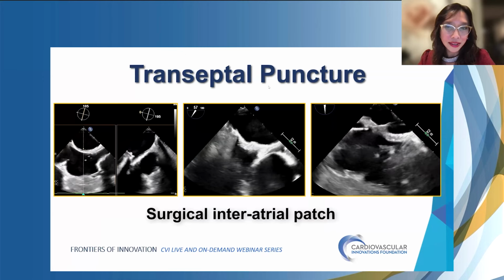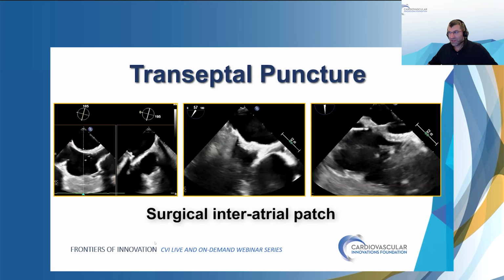And the next slide. So Nadira, just a quick comment here, and I would like to hear what Paul has to say. On the transeptal puncture, after multiple lessons and mistakes made, I think the transeptal height matters here. If you look at the curve that's made with the AngioVac, I think if you aim for 2.5 centimeter height, posterior mid, that would help.